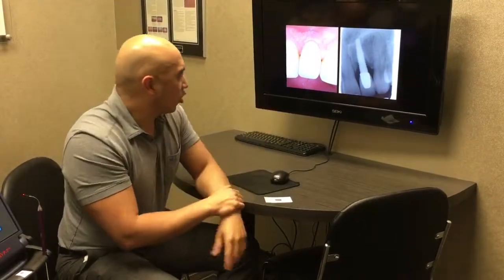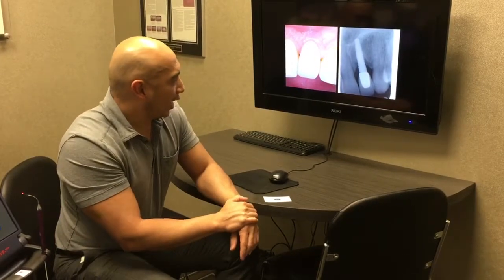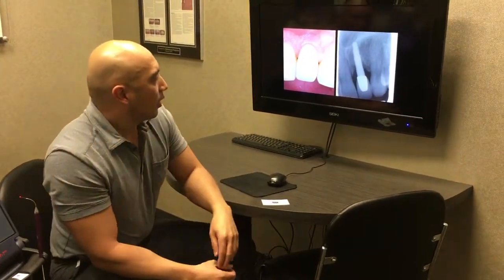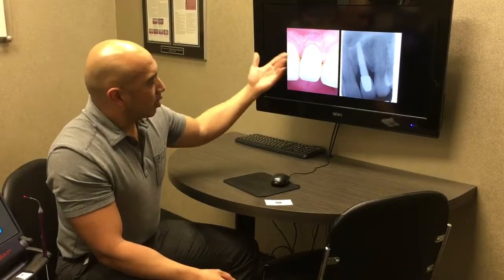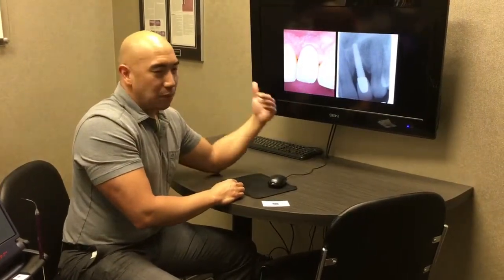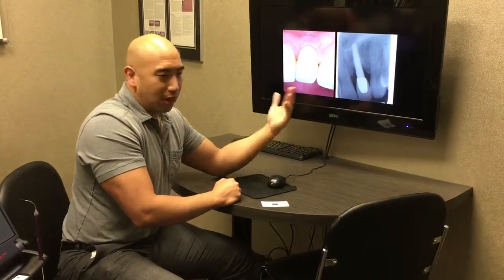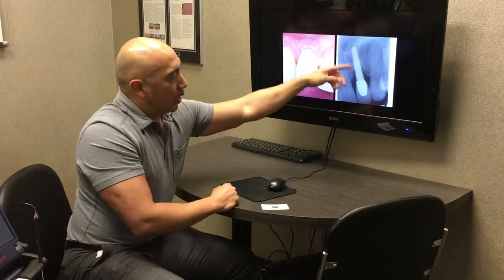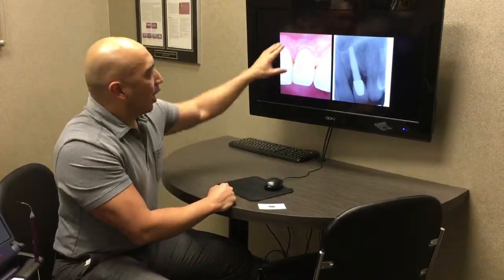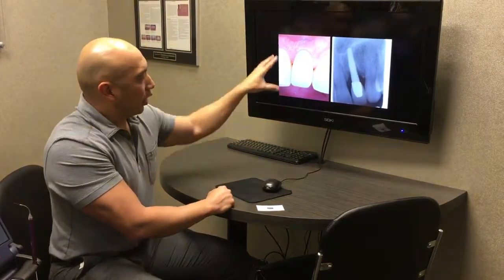So what I was actually doing, you guys caught me in the middle of my presentation here. We're just doing an example for some of our docs about what can happen with dental implants. So for example, we have a front tooth here where the patient is asymptomatic, but what they notice at the dental office with the dental hygienist is that the implant has some bone loss around it, and it's starting to affect the way the gum tissue looks around the tooth in the patient's mouth.